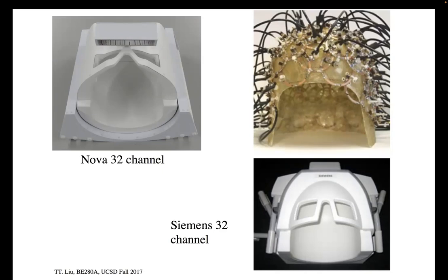Interestingly, the noise source is across the entire spectrum of your image. It's not a particular frequency. It's called white noise, right? It comes in at all frequencies. So to maximize your signal to noise, it's best to have a small coil locally picking up the signal here and picking up a small volume around that voxel, right?